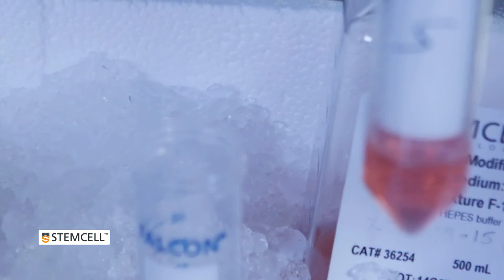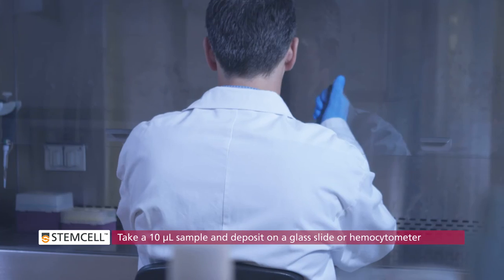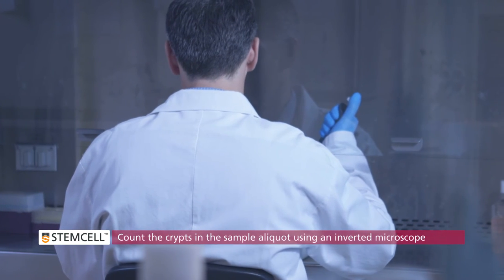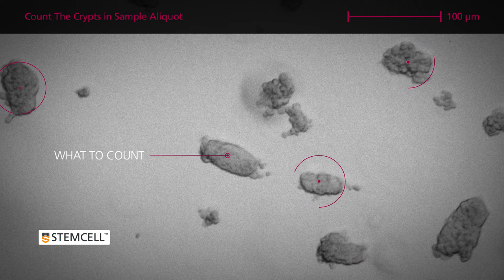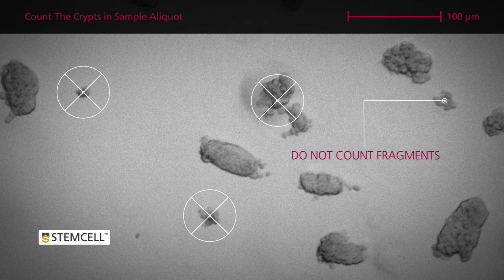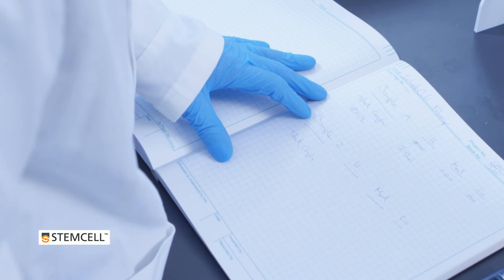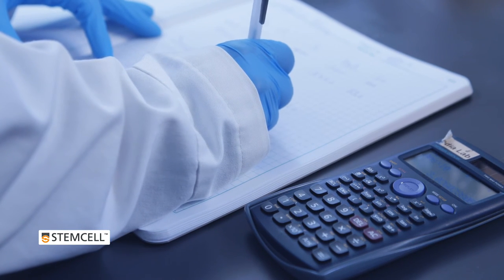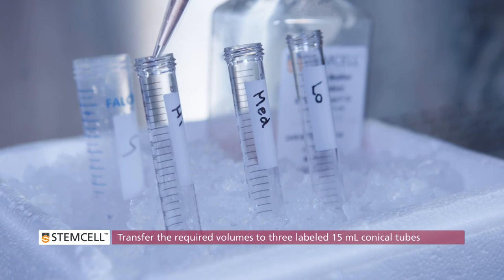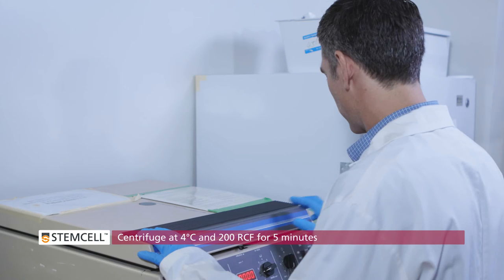For your selected fraction or fractions, take a 10 µL sample using a pre-wetted pipette tip and deposit on a glass slide or hemocytometer. This aliquot will be used to estimate the total number of crypts in the fraction. Count the crypts using an inverted microscope — the crypts look like small folded sections of epithelium. Do not count single cells or large multi-layered fragments of tissue. Multiply the count in the 10 µL aliquot by 100 to get the estimated number of crypts per milliliter. Calculate the volume of crypt suspension containing 500, 1500, or 3000 crypts, then transfer the required volumes to three labeled 15 mL conical tubes. Centrifuge at 4 degrees Celsius and 200 RCF for 5 minutes and pipette off the supernatant.